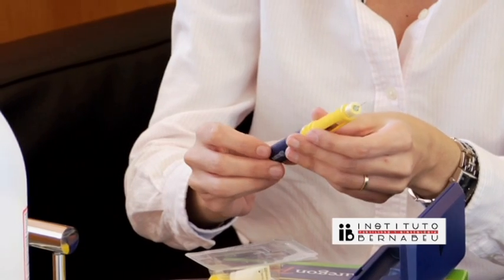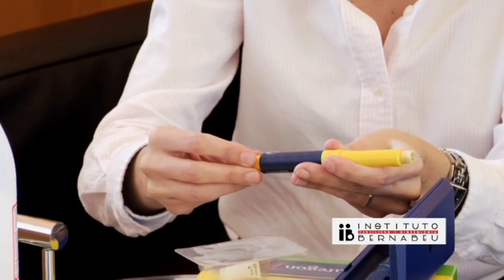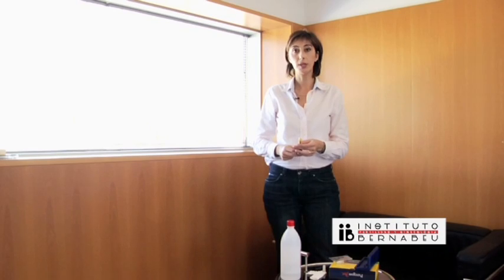Once the needle is in place, you must select your prescribed doses. You are now ready for your injection.